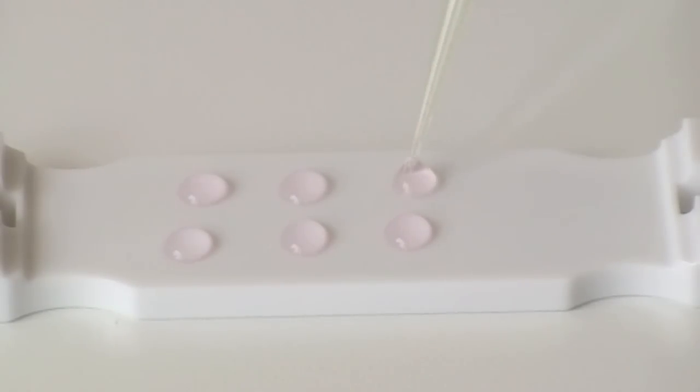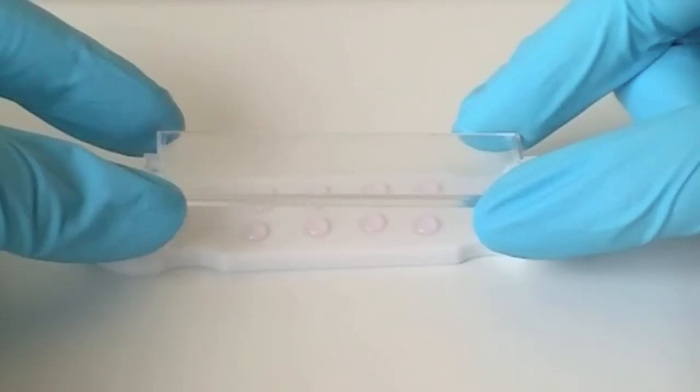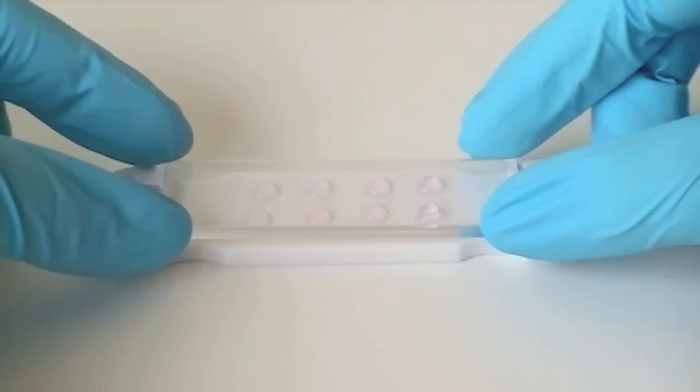When you are finished, use the top transparent slide to close the Q-Gel 3D disc caster carefully and press it firmly to flatten the drops and make little discs. Remember you have 5 to 6 minutes to work with the solution before it becomes a gel.